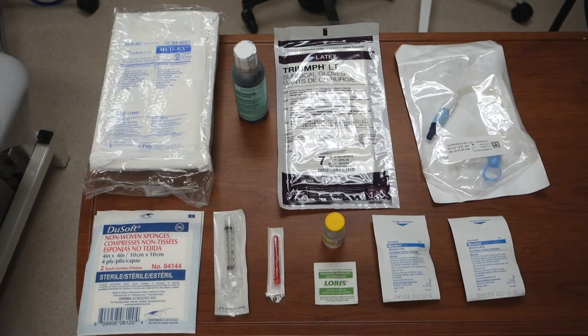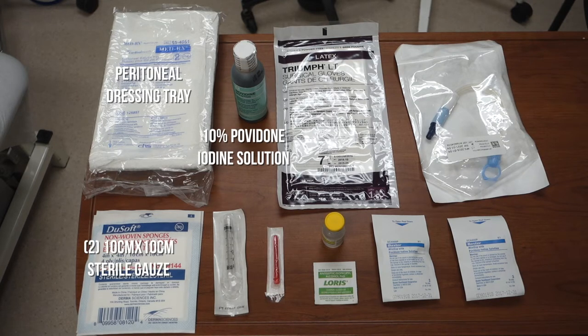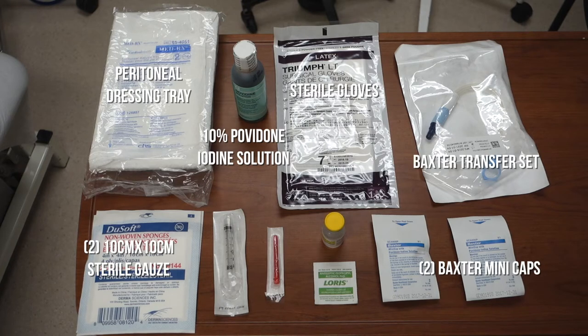You will need a peritoneal dressing tray, 10% povidone iodine solution, 2 packages of 10 x 10 cm sterile gauze, sterile gloves, a Baxter transfer set, 2 mini caps, 1 3cc syringe, 1 vial of 0.9% sodium chloride, an alcohol swab, and a blunt fill needle.